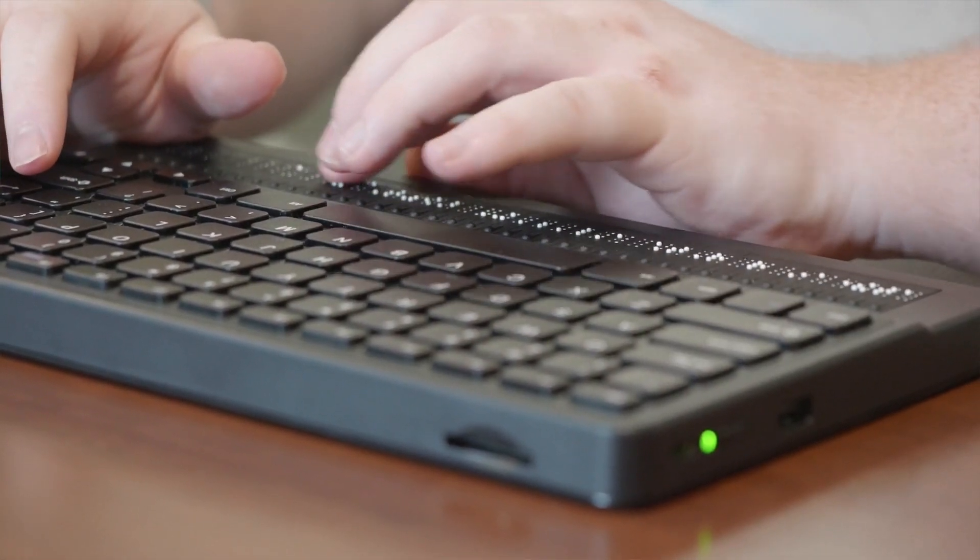The Mantis is the first of its kind. There's never been a refreshable Braille display with a QWERTY keyboard attached to it that functions as a Braille display. When you're using a QWERTY keyboard, oftentimes you don't have the Braille display there. You're listening to a screen reader only, and so you're not getting things like spelling. You're not getting things like punctuation.